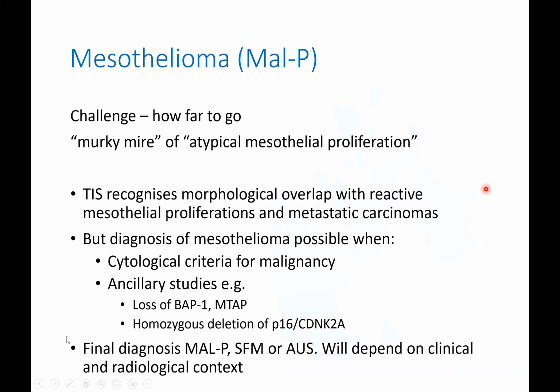Moving on to malignant mesothelial cells. Now, these can be a challenge in cytology, especially how far to go in terms of a diagnosis. And I wouldn't say it's so much of a pitfall, but more of a murky mire. In the UK especially, we often end up calling abnormal mesothelial cells atypical mesothelial proliferation.